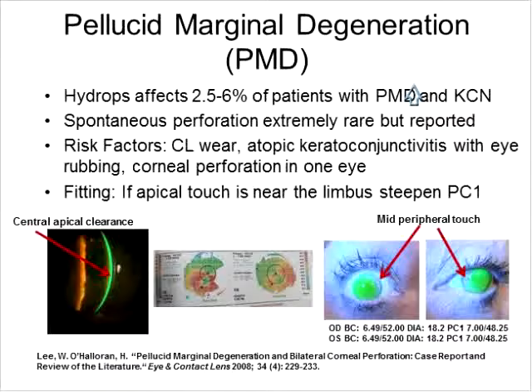Visionary Optics will do a front surface design on a scleral lens, and Visionary Optics will also do toric peripheral curves when needed. And in addition, scleral lenses can be plasma treated more than one time, as Dr. Johns mentioned earlier.